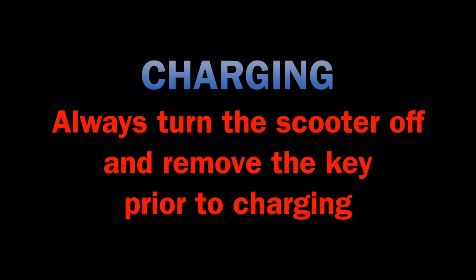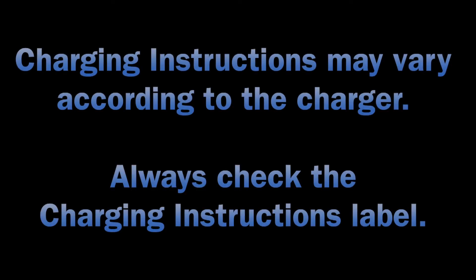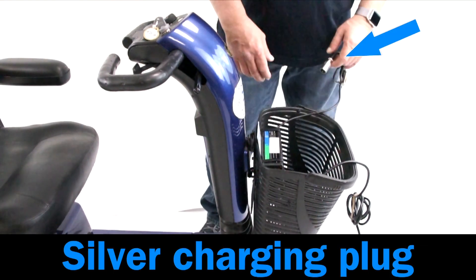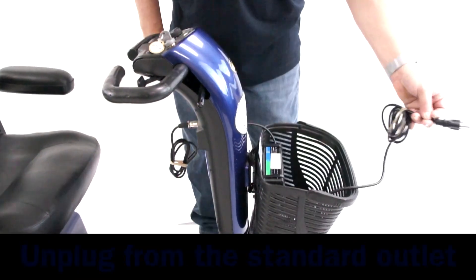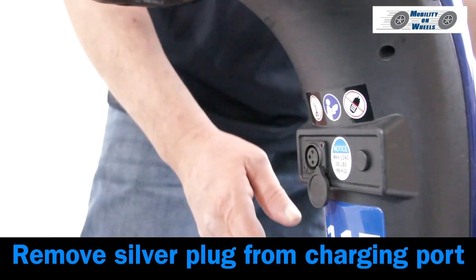Charging the scooter. Always turn the scooter off and remove the key prior to charging. The charger is located in the basket; instructions are written on the charger. Charging instructions may vary according to the charger — always check the charging instructions label. Insert the silver plug into the charge port located in the rear of the tiller. Plug the power cord into a standard wall outlet. To finish, unplug the charger from the outlet, remove the silver plug from the charging port, and close the charging port cover. It is recommended you charge your scooter each night.